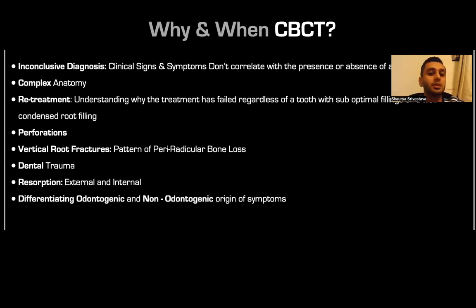A CBCT will tell you the margins of a lesion, if it's associated with the tooth or not. Pre-surgical treatment planning. So assessing anatomical landmarks when you're doing surgery, that will help as well. I've not added any cases on this because it's a very vast topic. But apart from this, for everything else, there is a case to talk about with regards to why and when CBCT.